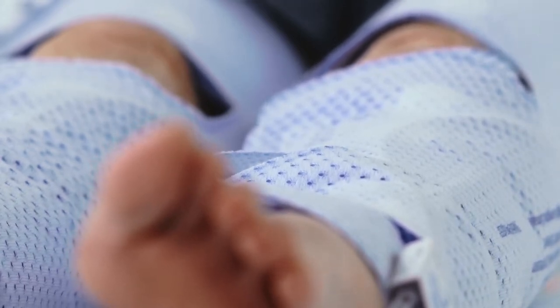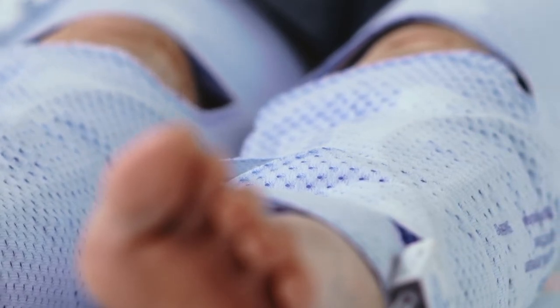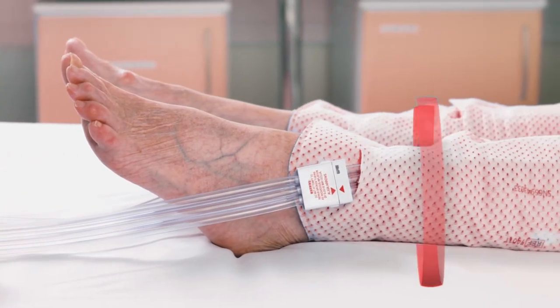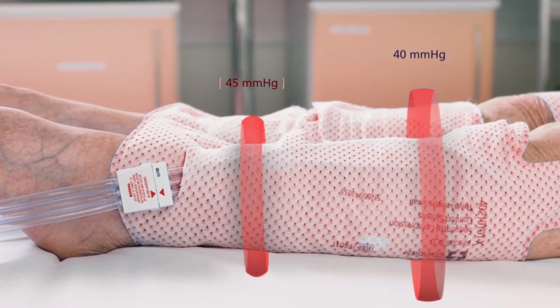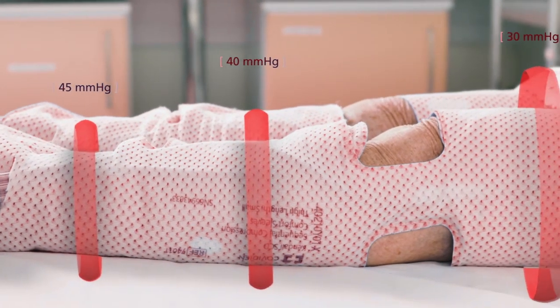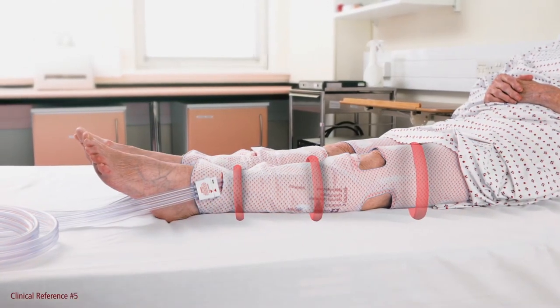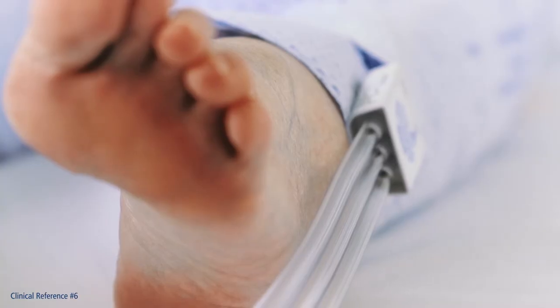The sleeves also compress alternately, one leg at a time, to mimic the action and hemodynamic benefits of walking. Each sleeve has three separate bladders which inflate sequentially, beginning at the ankle at 45 mmHg, moving up to the calf at 40 mmHg, and ending at the thigh at 30 mmHg. This sequential gradient compression maximizes femoral blood flow velocity, promotes unidirectional blood flow, and reduces the risk of blood staying trapped distally.